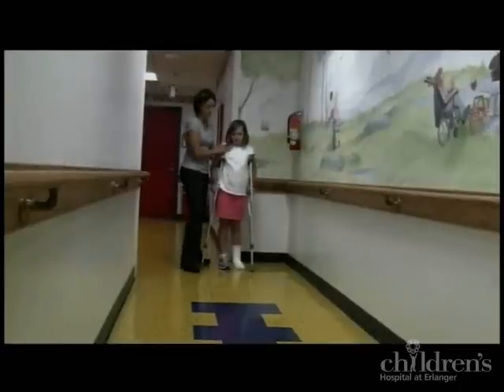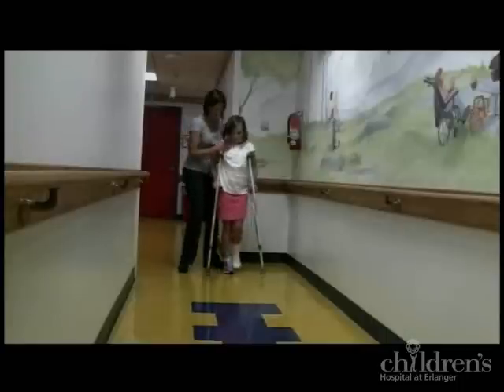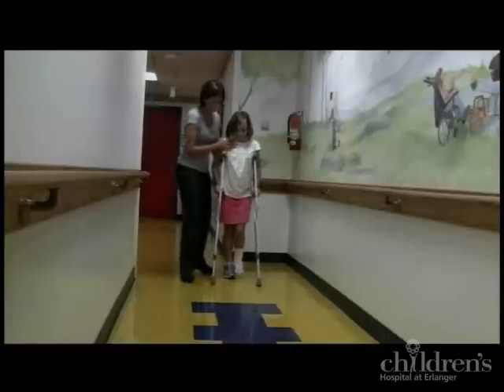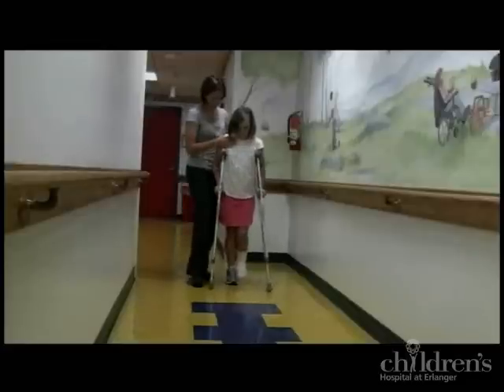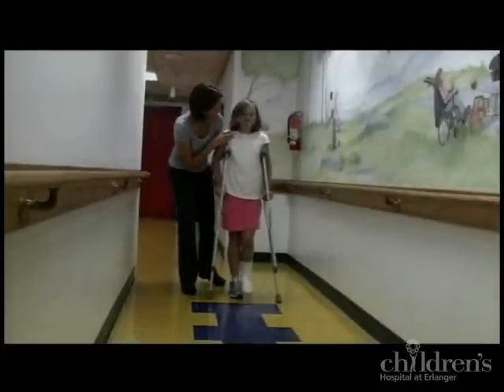One thing you don't want to do is be overly cautious, because that can cause loss of balance with your child on their crutches as well. So let's go ahead and walk — this is a way not to guard your child. Does that make it a little harder for you to walk with me real close?